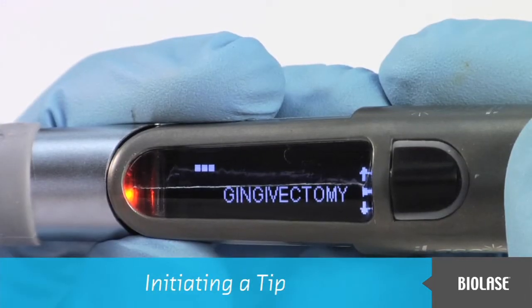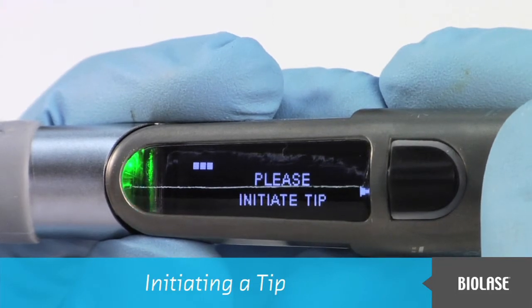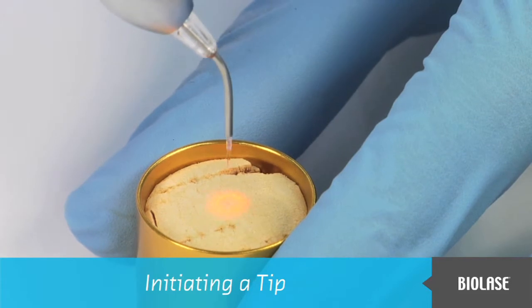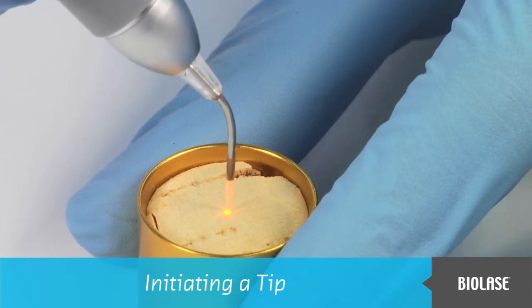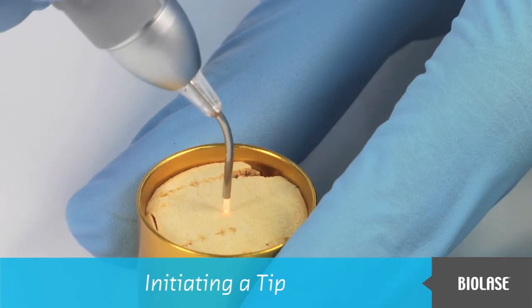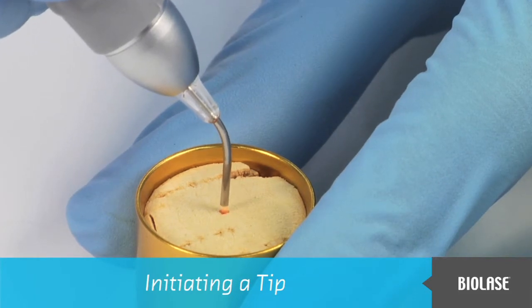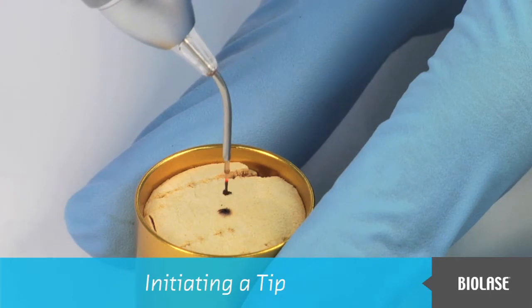After selecting a procedure, the iLase will ask you to initiate a tip in order to properly cut tissue. Touch the iLase tip to the surface of the initiation block without firing the laser. Now, fire the laser, allowing the tip to sink into the block. Count 1, 2, 3. Pull the tip out of the block. Count 1, 2. And stop firing. At this time, the tip should be out of the block.